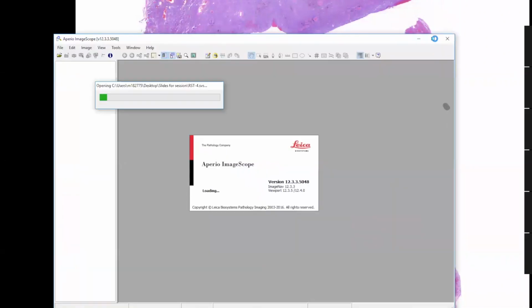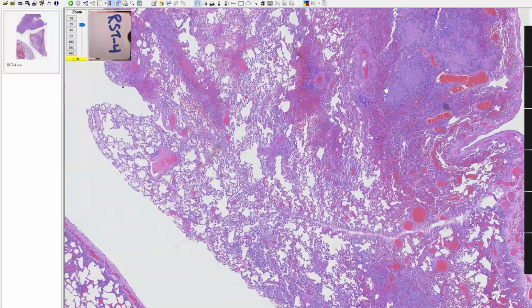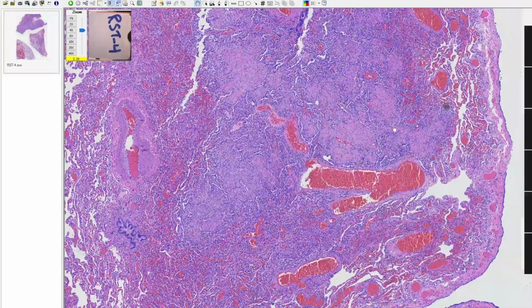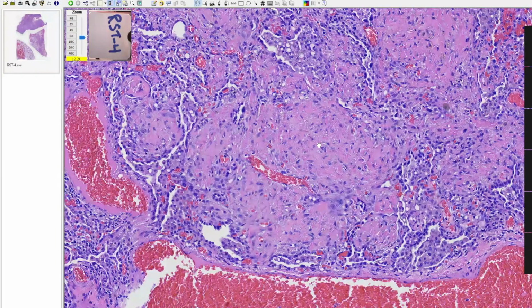So one last case here in our spectrum of acute lung injury cases. So here, once again, we have a patchy process, and we have this abnormality that's localized here. And once again, the abnormality is within the air spaces.